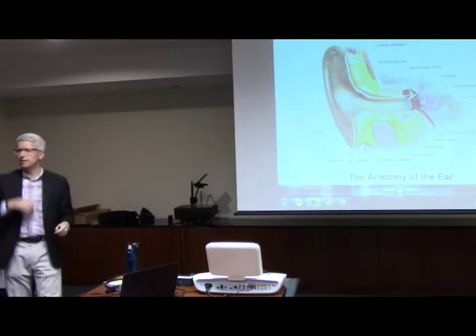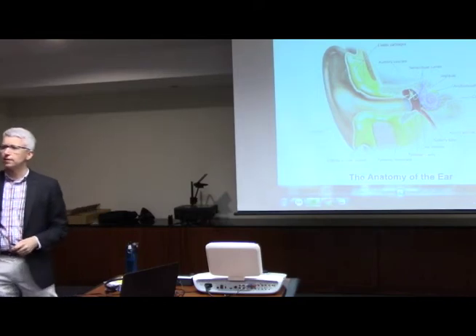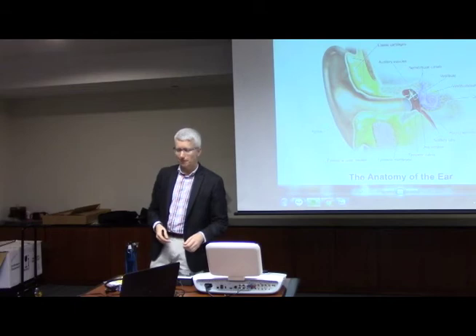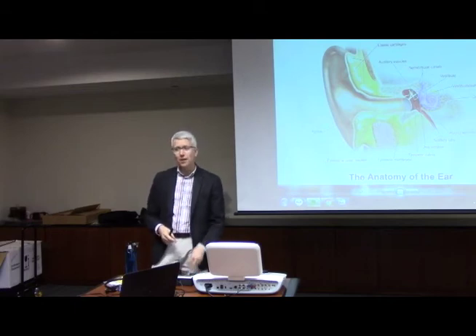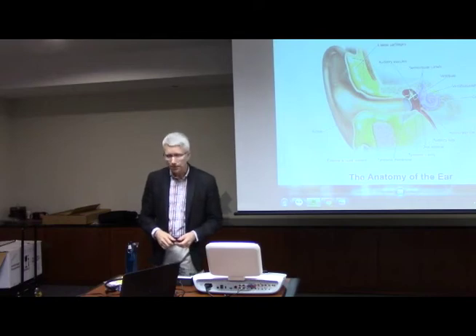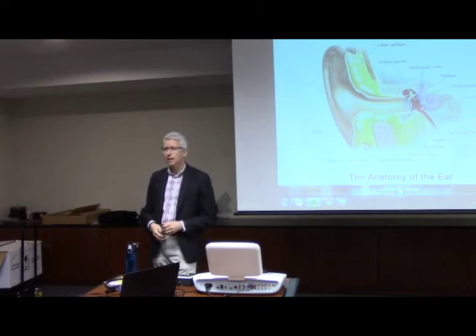I have a question. Yes. What kind of batteries does that take? This one takes 2 AAs. And what's the battery life on that? For something like this, they last quite a while. I mean, you would get probably days of testing out. That AirScan takes 3 AA batteries, and that'll last the school all year. Oh yeah? Seriously? Yeah.